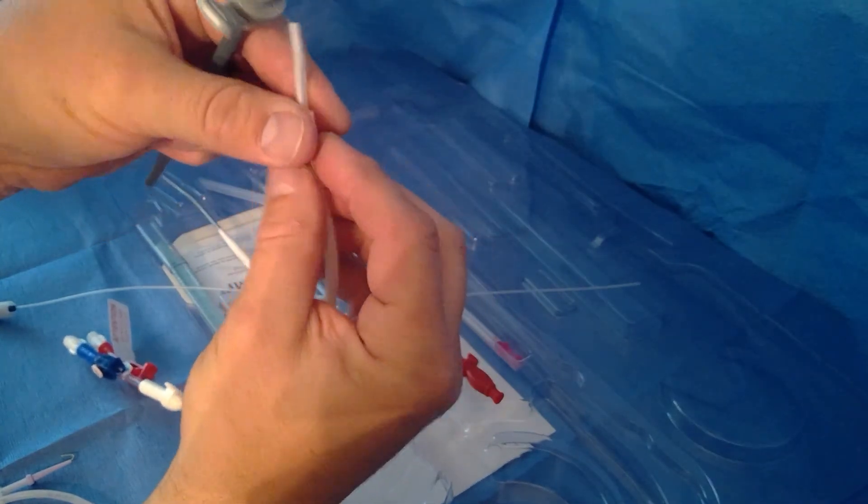You want to make sure you're not kinking the sheath during any of the process of insertion. If you kink it, you're going to have issues. Don't peel away before you start feeding the catheter in. Just feed the sheath all the way in until it's hubbed, catheter together nice and smooth, not flipped or tangled in any way. Feed it through and you're good to go.